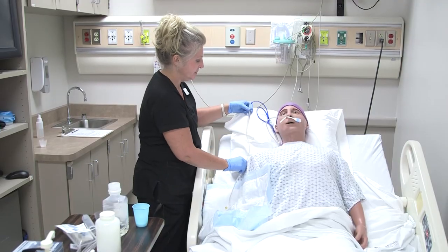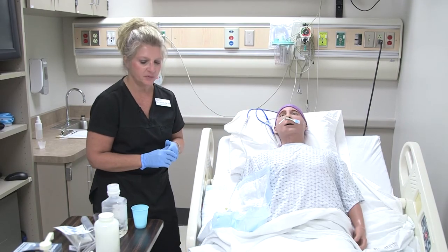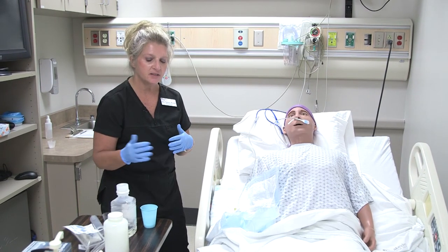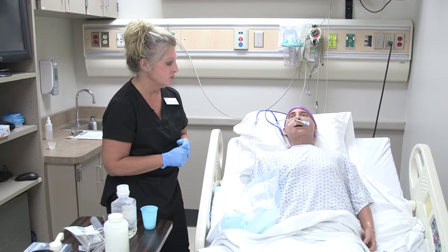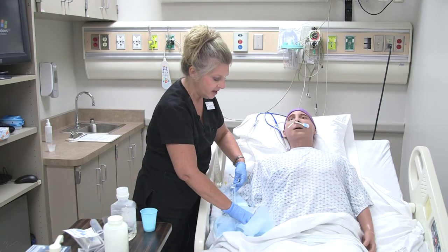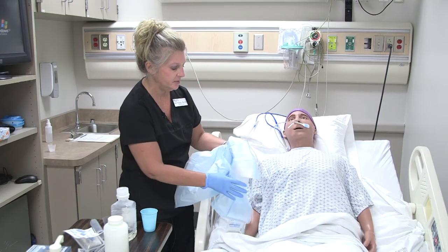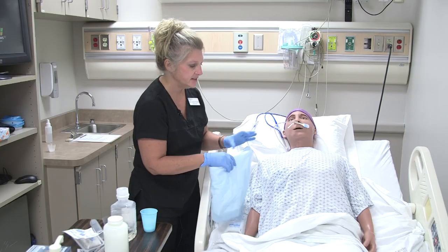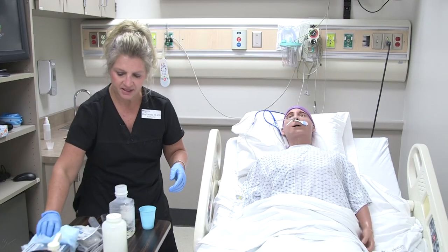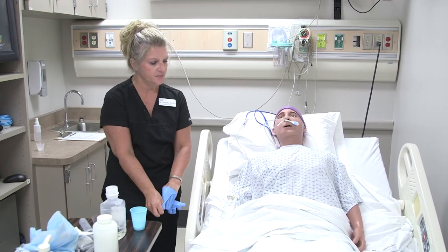The patient has now had their tube feeding. If this patient were hooked up to suction — since this type of NG tube can also be connected to suction — you would wait at least 30 minutes to an hour before hooking it up, otherwise it will just suction out the food you just gave. Afterwards, ask the patient if they're having any cramping or bloating, document that you administered the tube feeding including how much, what type, and confirm everything is documented correctly. Ask if they have any questions, lock and lower the bed, put alarms on if needed, and place the call light and tray table within reach. That concludes the tube feeding by gravity.